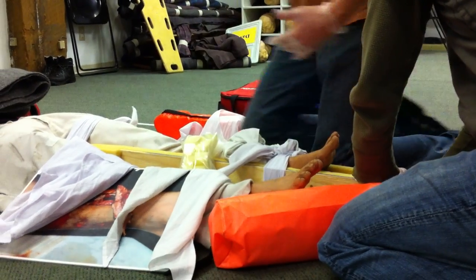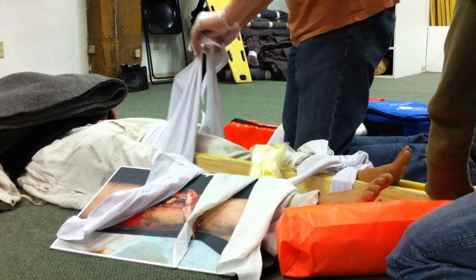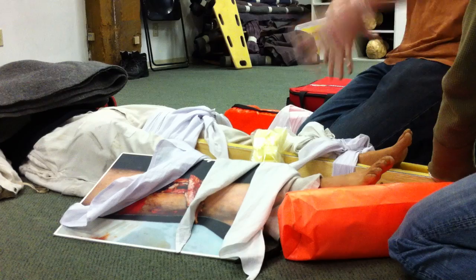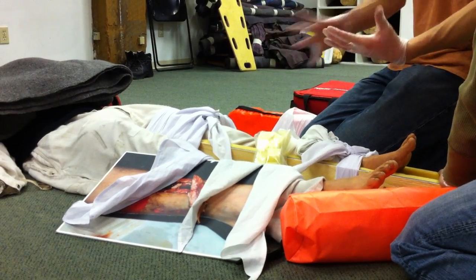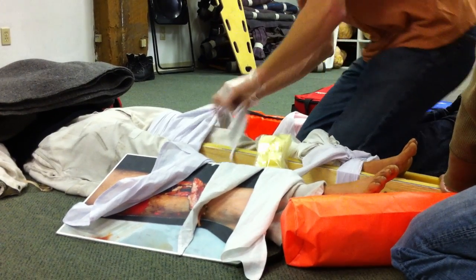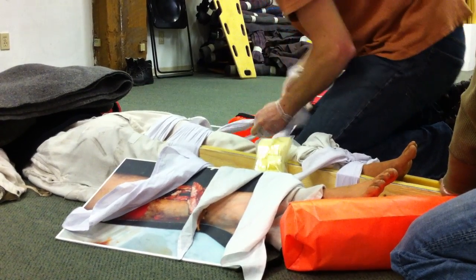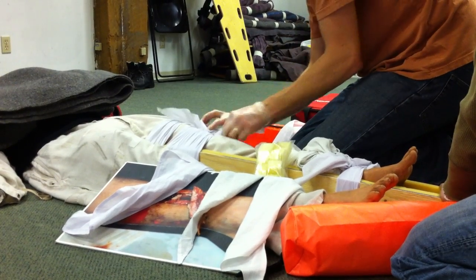And then we go back up here and we work down. So you start at the top and then the bottom, because otherwise, if you're tying the top, they kind of twist, like what happened when I tied it. They want to move. So we have somebody hold it, then we tie this. I have him stay here just because it helps out. This holds it together as I pull all the rest. And again, you'd be incredibly gentle and loving with all of this.